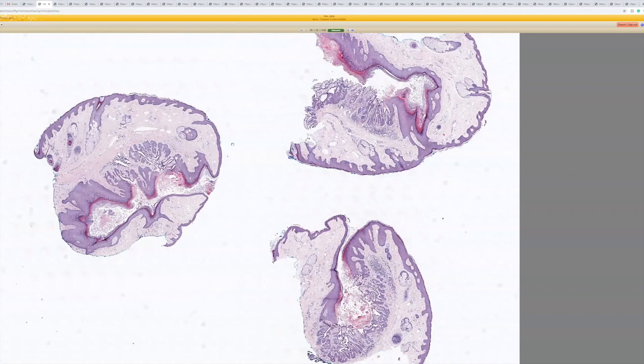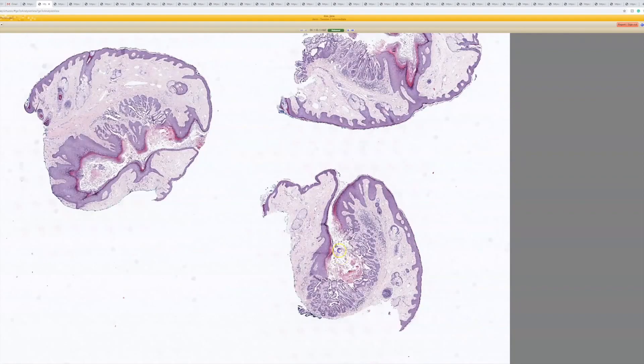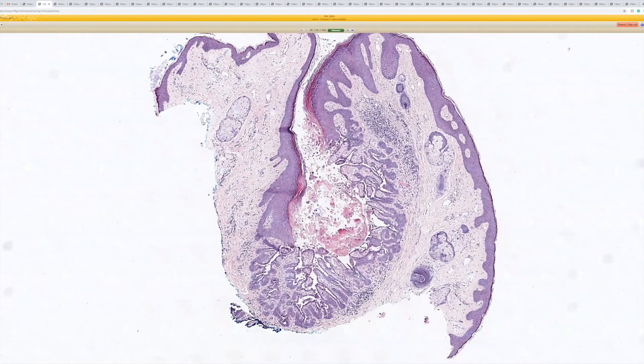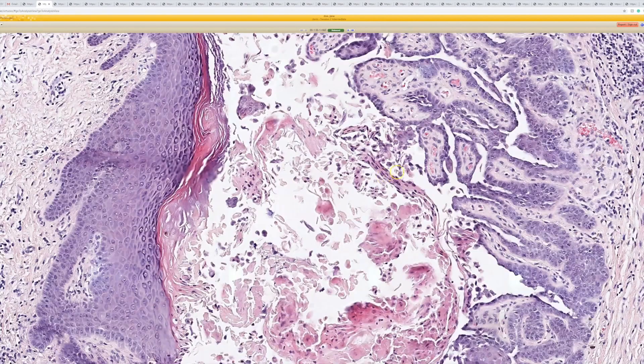Again, I can go ahead. So it looks like an endophytic kind of growth, where it's kind of invaginating. And it looks like there's maybe acantholysis. Good. And it kind of looks like an expanded hair follicle.